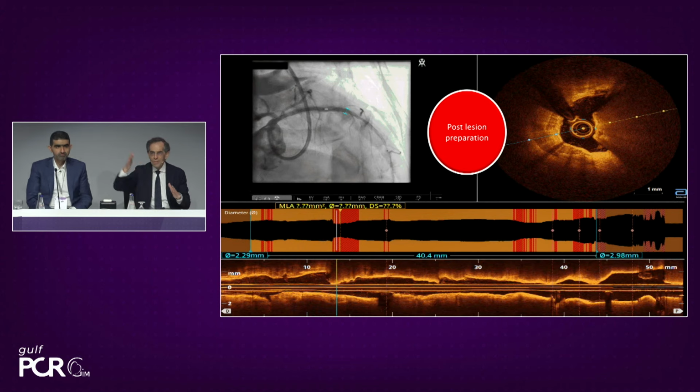You don't need to have people stay away from the table telling you more or less what you have inside. You are controlling as a single operator from the table, and you know exactly the content, and you know exactly where this type of lesion or incomplete result is.